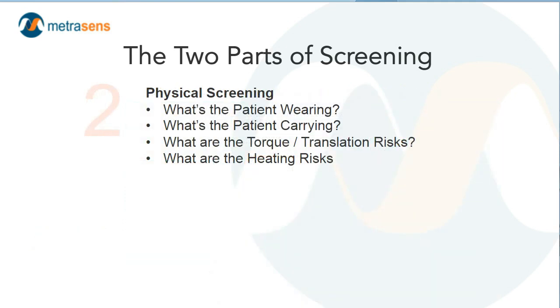After we screen them for clinical contraindications, we want to make sure we identify any physical contraindications. And these are primarily what patients are wearing or carrying. This can be clothing items. This can be stuff in their pocket. This can be shoes that look like athletic trainers but are the concealed roller skate shoes that the kid is wearing. So we want to identify objects, material being worn or carried by the patient, by the subject, by anyone entering the controlled access area.